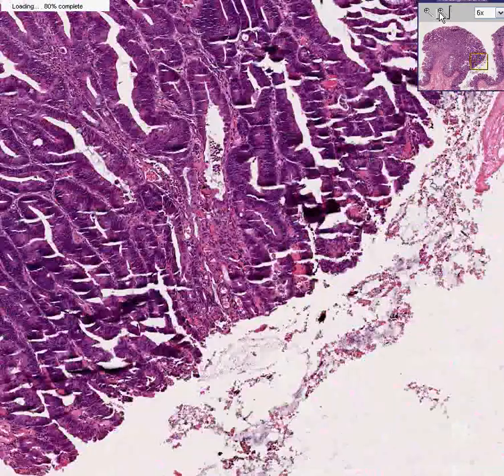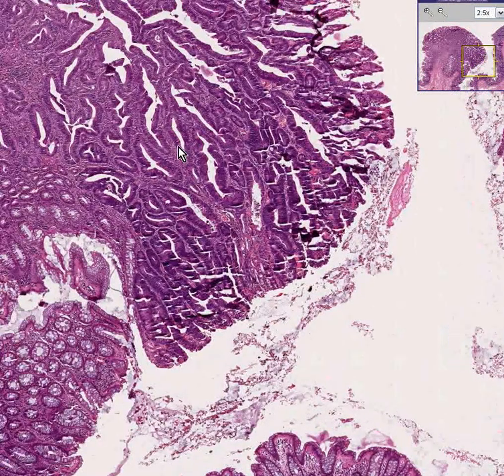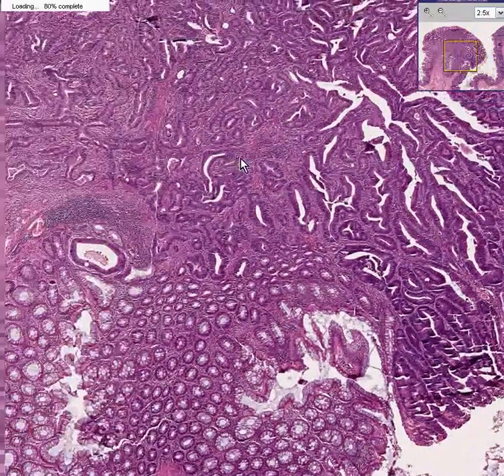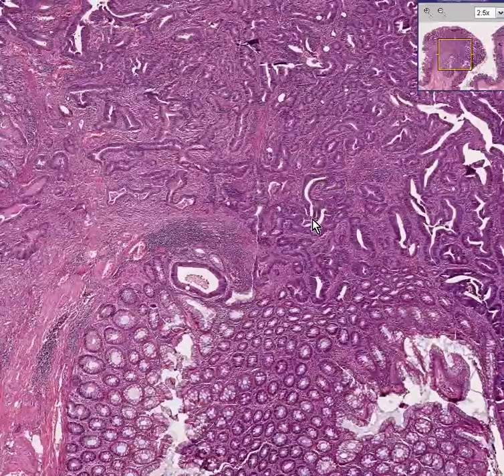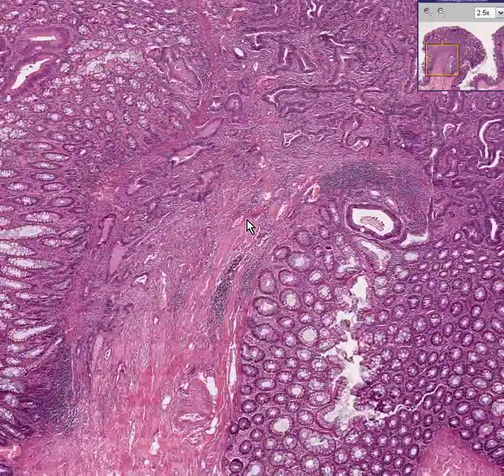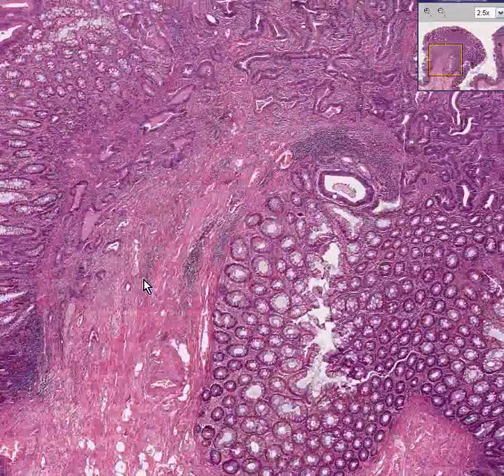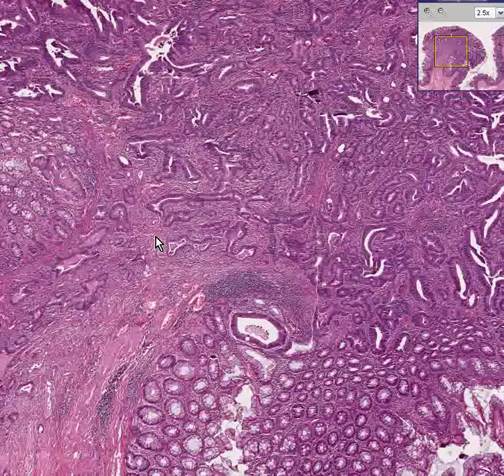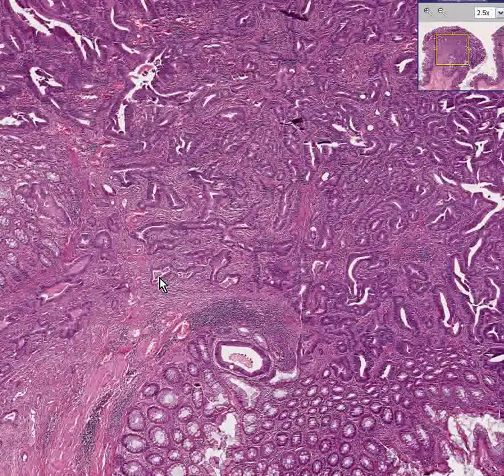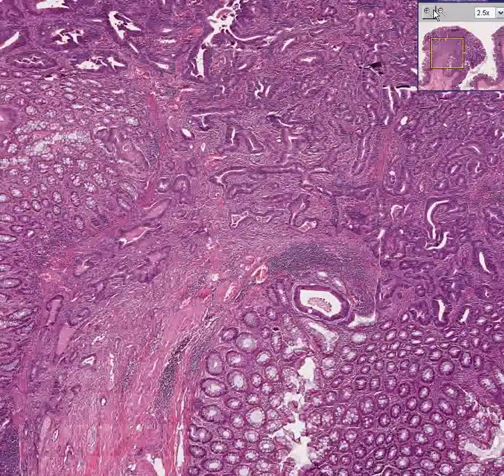Now, do you remember when I told you that sometimes these adenomatous polyps can turn into cancer? Well, look what happened. This one did turn into cancer. And by the time you know that this is the polyp over here, but some of these glands of the polyp have decided to invade into the connective tissue of the stalk.